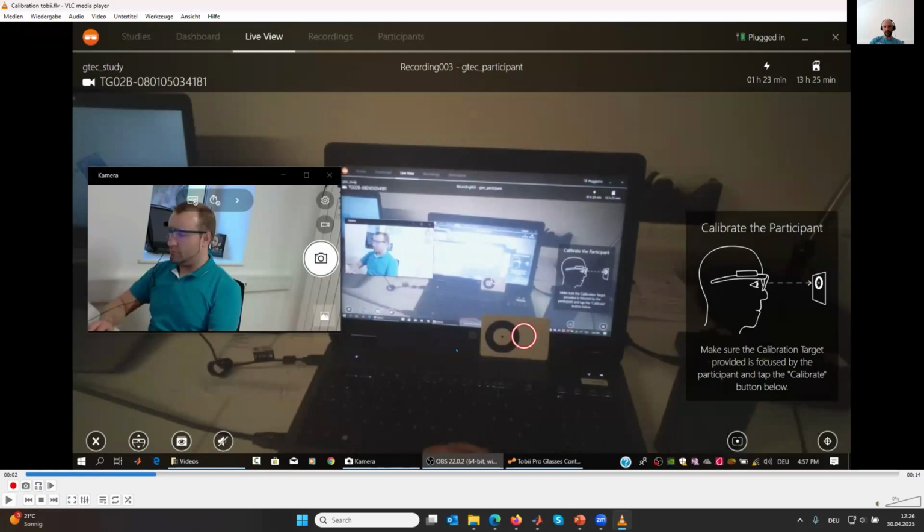And this process is done automatically whenever you start the Simulink model. So the first thing, if you start the Simulink model, is watching the calibration card so that the device can perform the calibration. This ensures that the eye tracking is accurate for each session.